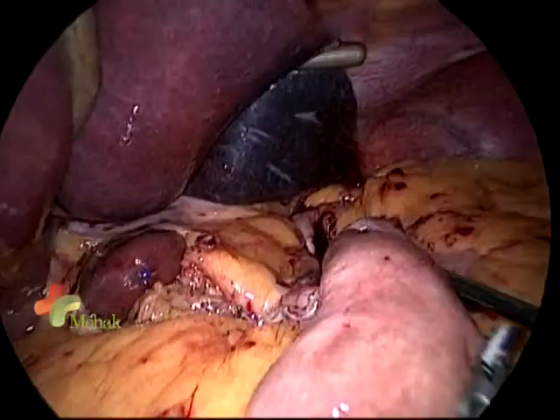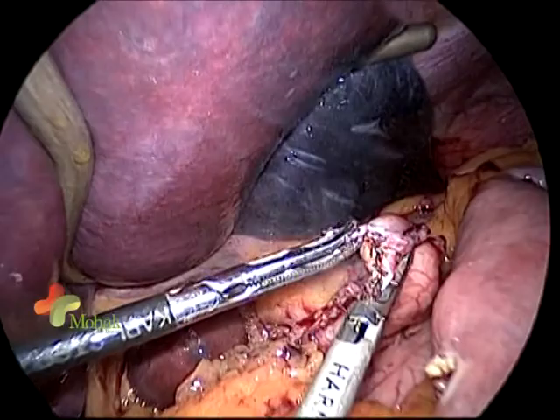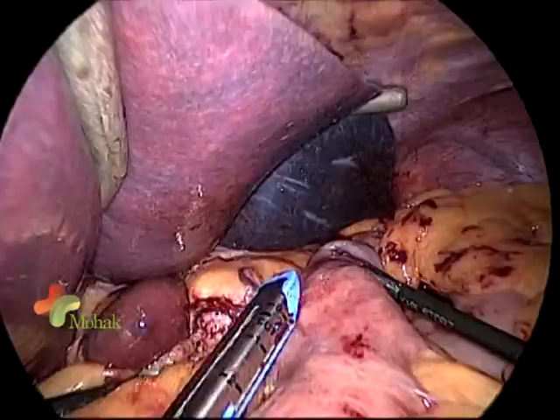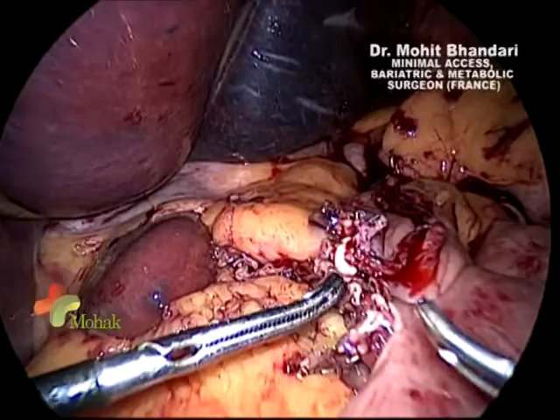The pouch is now created. We bring the loop of jejunum up and make an enterotomy, dilating it. We then make another enterotomy at the junction of the horizontal and vertical staple lines of the stomach and dilate both the enterotomy and gastrotomy. The stapler is introduced and we fire it exactly at three to three and a half centimeters, pulling the bougie inside the pouch and then firing the vertical staple.